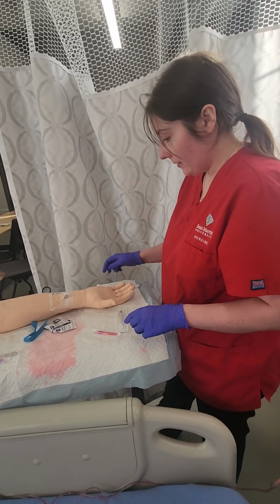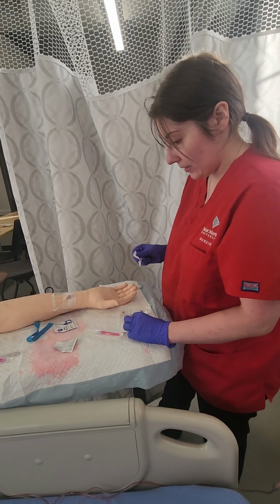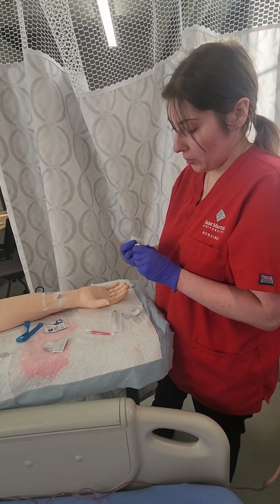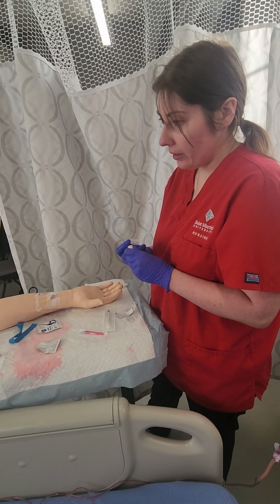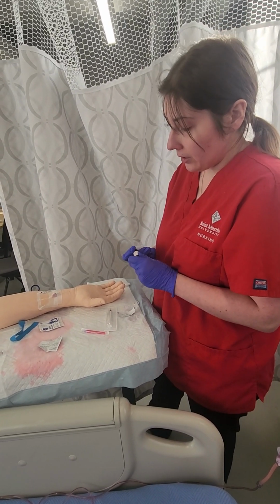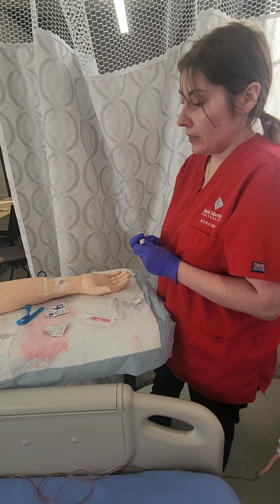So right here, I'm gonna set this, get this all set up. Cleaning the top here, I have morphine sulfate, 10 milligrams per ml. I'm going to be drawing up 0.3 mLs for 3 milligrams for Mr. Scott.